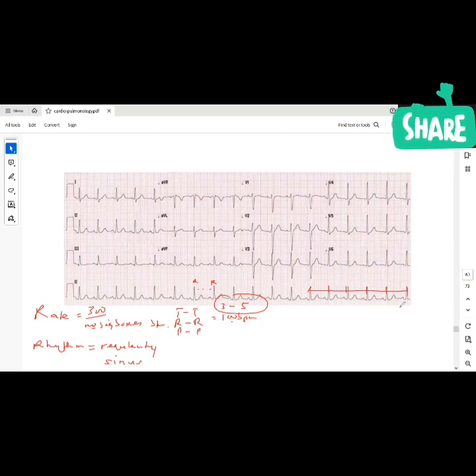So what about sinus? What does a sinus rhythm mean? Sinus rhythm is a rhythm that is P, QRS, T. It means that the P wave must always precede the QRS. So I'll see P followed by QRS followed by T. P followed by QRS followed by T. If I see QRS before P, or I see P after QRS, things like that, that's not a sinus rhythm. Does that make sense? So far so good?